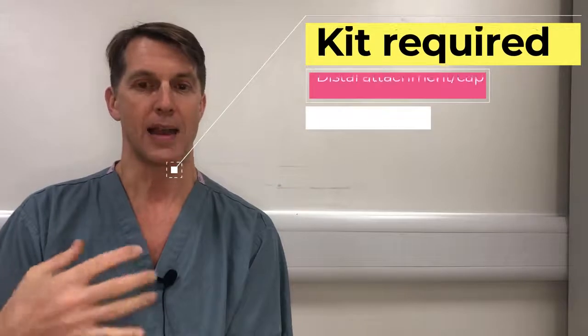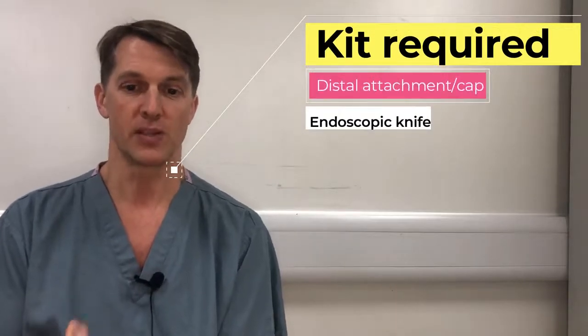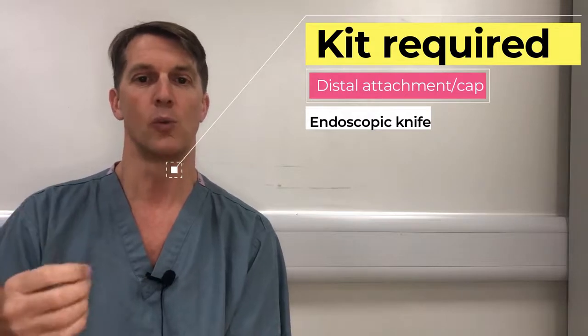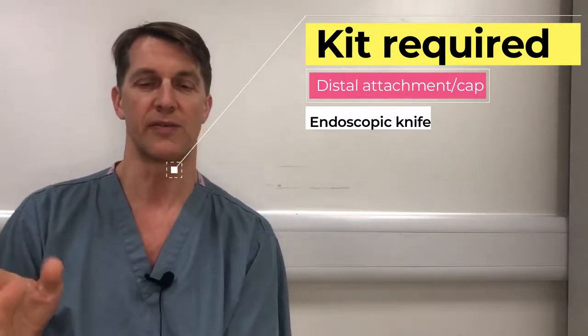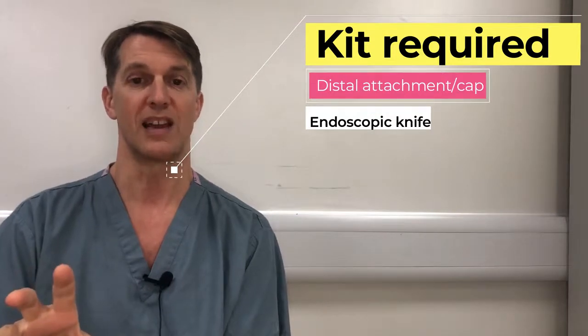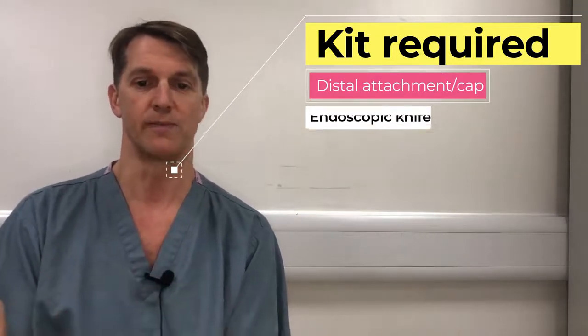Now, the kit is fairly simple. You need a cap or a distal extension on the scope, and a knife to do the cutting. My personal preference is the Erbe hybrid knife, which is a very powerful water jet that runs through the center of the knife and allows you to maintain significant submucosal elevation, and that improves your vision.